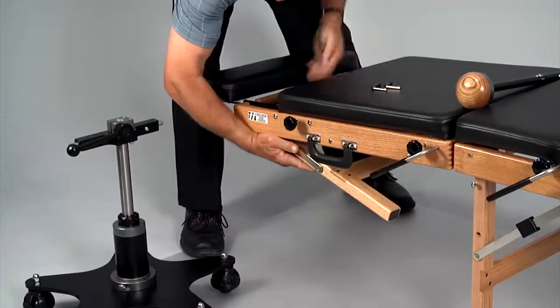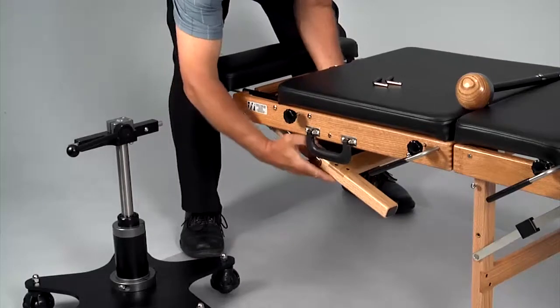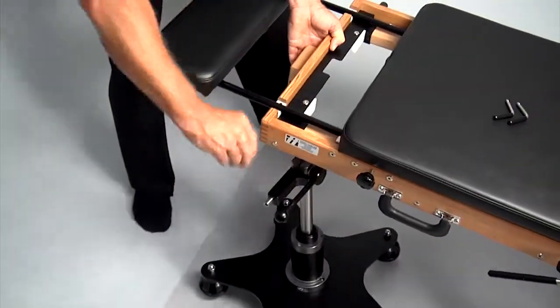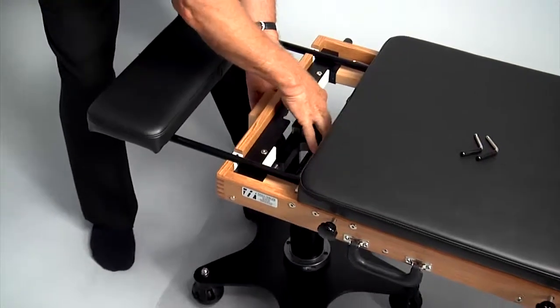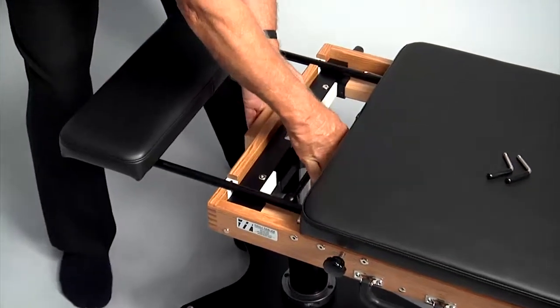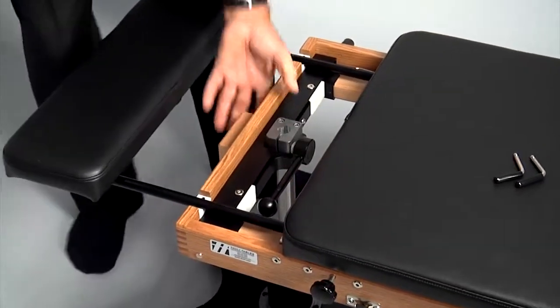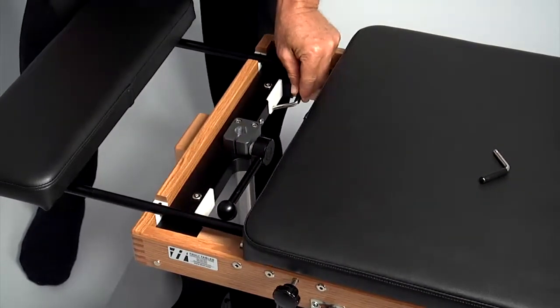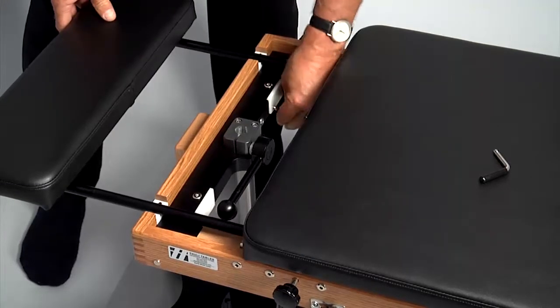The hinge locks must be all the way forward for the legs to fold properly. Roll the flexion distraction device under the back of the table. Set the back of the table onto the device, lining up the slots on the white housings with the tabs on the flexion distraction device. Use the mid-leg support pins to secure the table to the device.